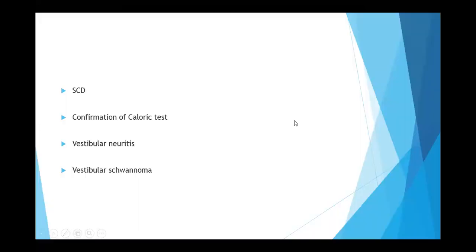So is it possible to record without the VEMP module? Yes, we can record with the ABR module, but we really cannot rely on the responses. Okay, so I think that's it. Any doubts in this?